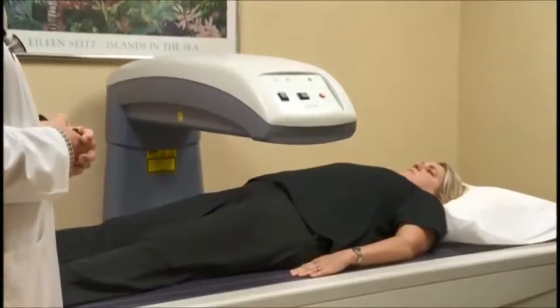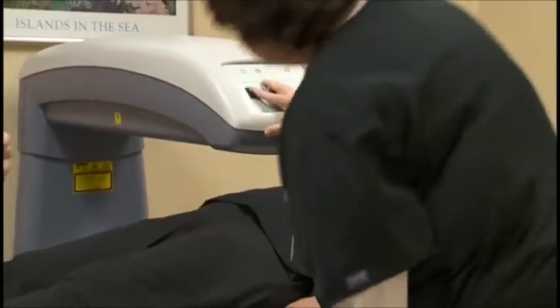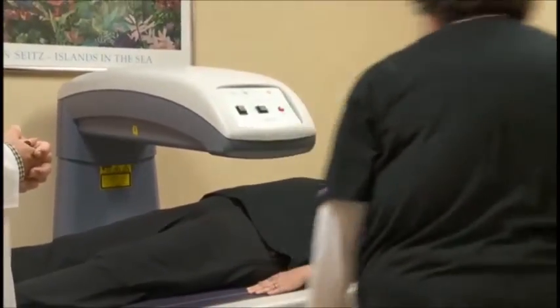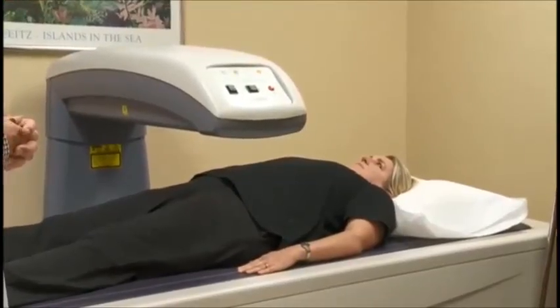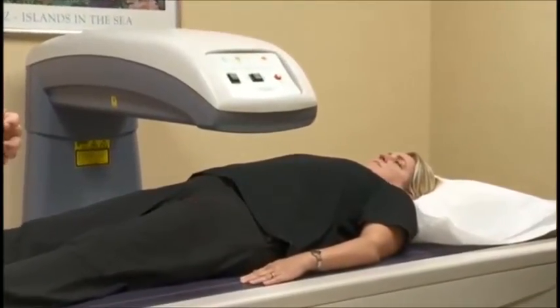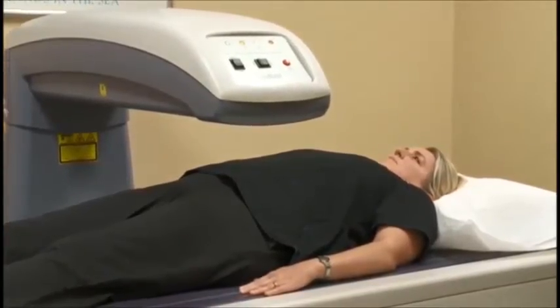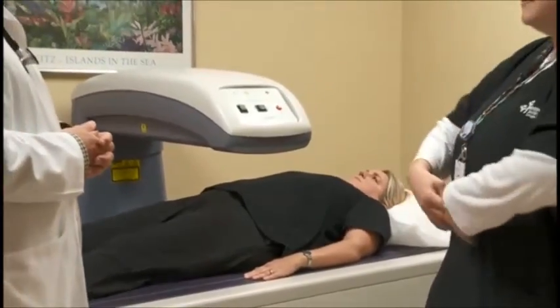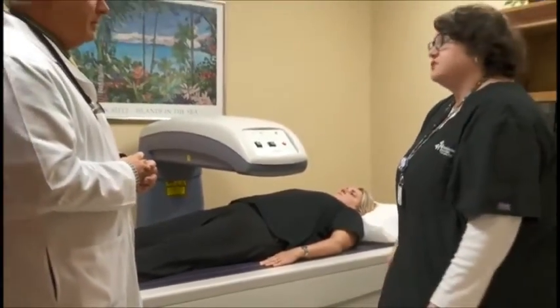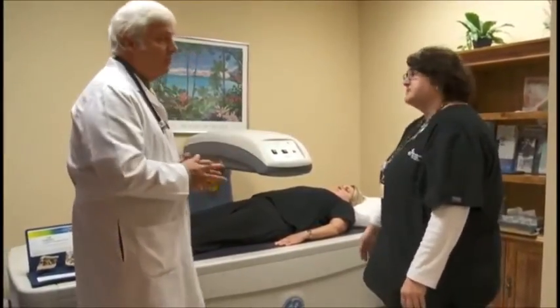As you can see, it's an easy test. It's non-invasive. The patient just lays still, and we just scan both hips and get the average of those. So as you can see, it's going to start scanning. It's very non-invasive for our patient. As long as they're not wearing any zippers or metal, they don't have to get undressed. We just fold them out of the way, so it's very non-invasive. It's easy for the patient to do. So easy, just come in here, basically lay down. Talk to me, we do the test.